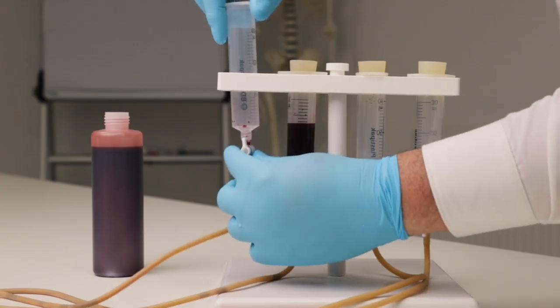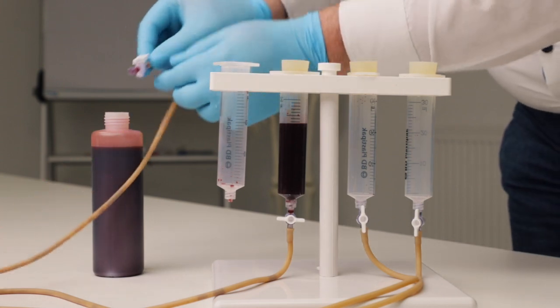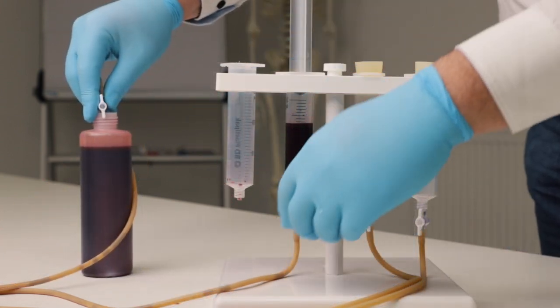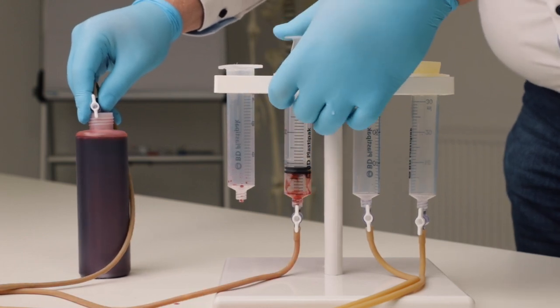To empty the system completely, use the blood bottle and put the end of the vein tube into the bottle. Open the stopcock and press the blood into the bottle using the piston.